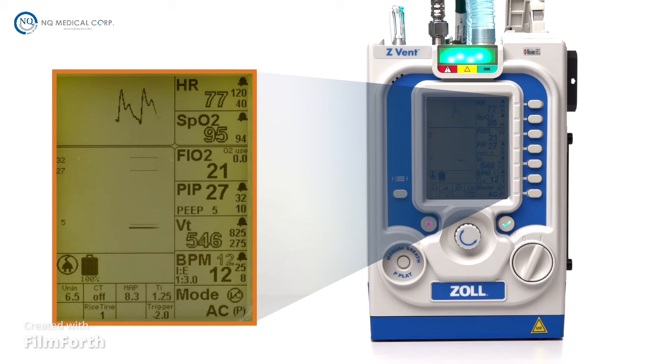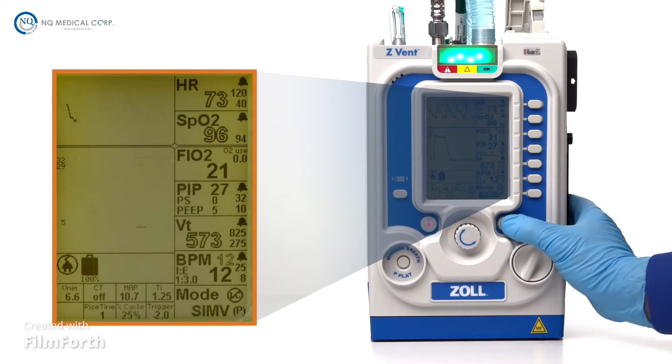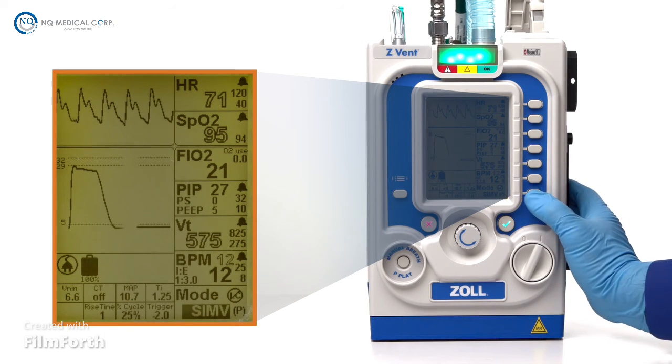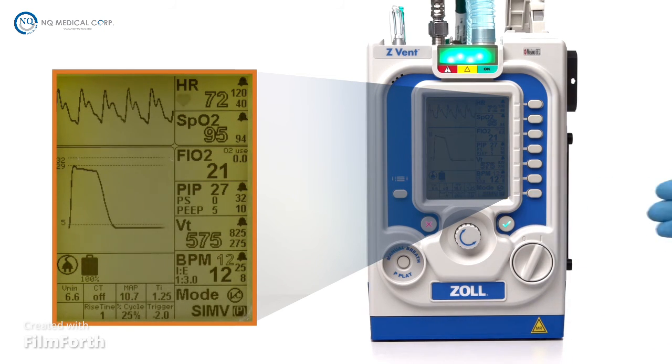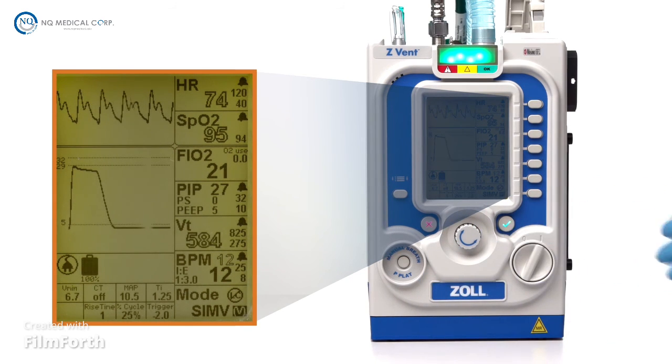In synchronized intermittent mandatory ventilation, or SIMV mode, the patient receives control breaths based on the currently set breathing rate. Spontaneous breaths are either demand flow or supported using pressure support. This is displayed as either SIMVV, indicating volume-targeted breathing mode, or SIMVP, indicating pressure-targeted breathing mode.